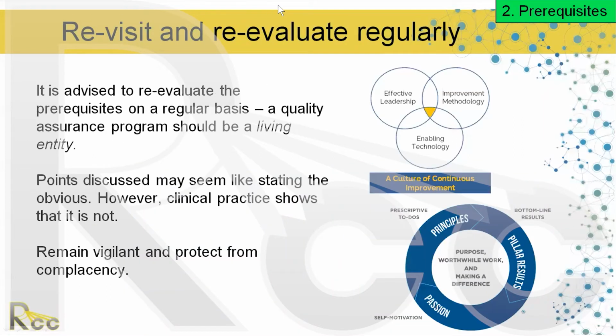All these things, and this is something I want to stress, you don't just set up a program and then you've got a program. It's a living thing, because it's made up of humans that come and go. You may have to retrain people. You may change an element of your equipment. So whatever you made on day one, you're not going to be using for the next 10 years. You should be revisiting it periodically, and it should be living and evolving with your institution and your practices. So these are some elements of a culture of continuous improvement.